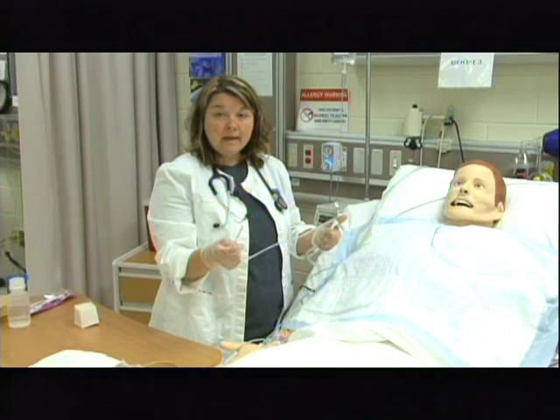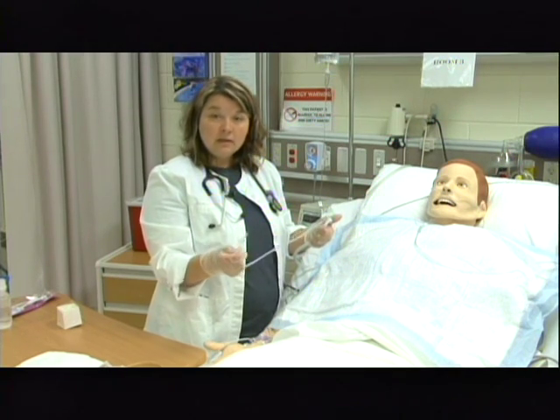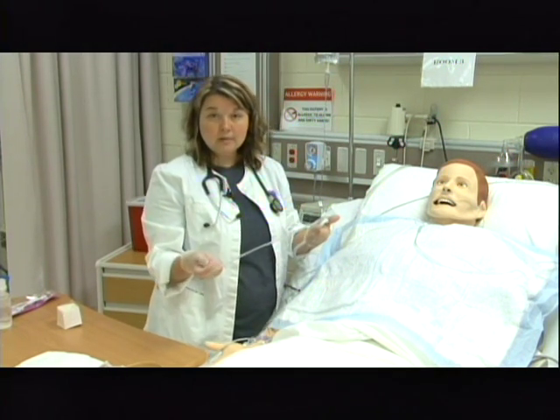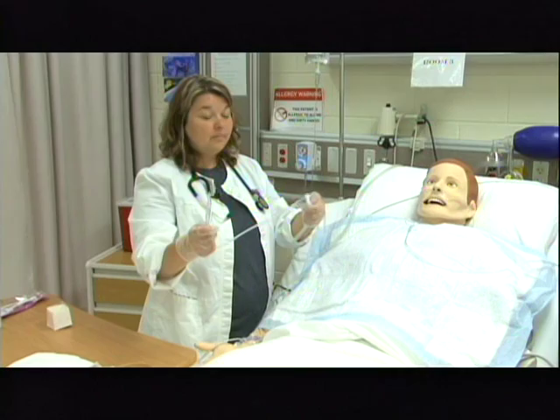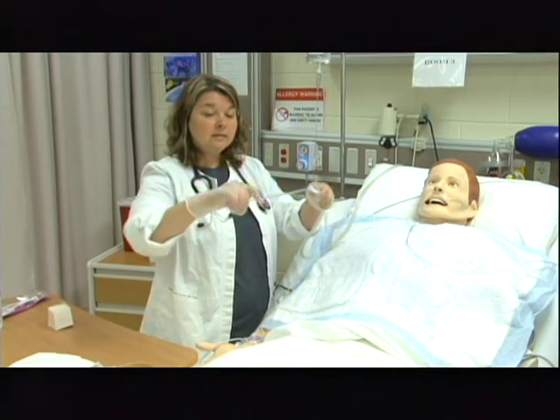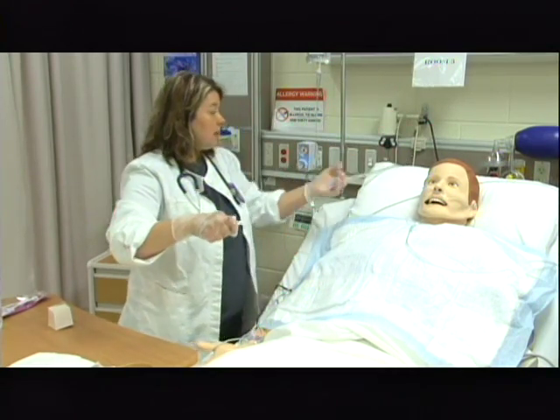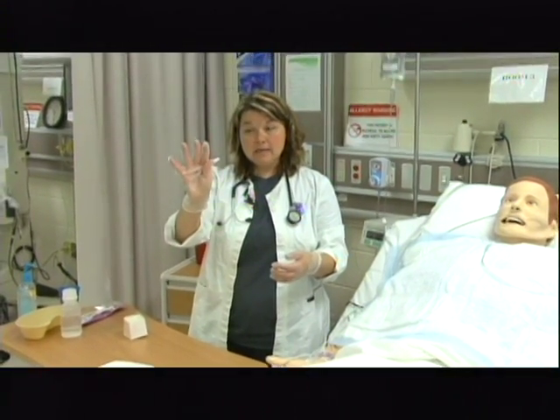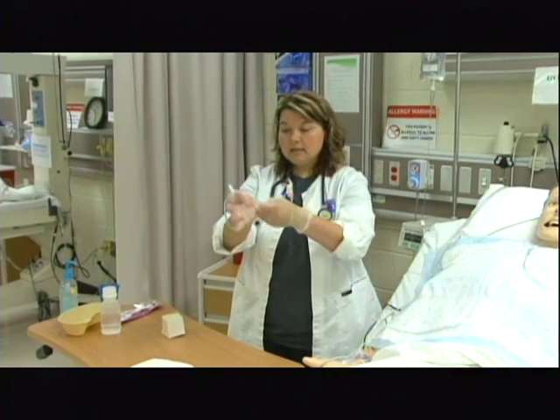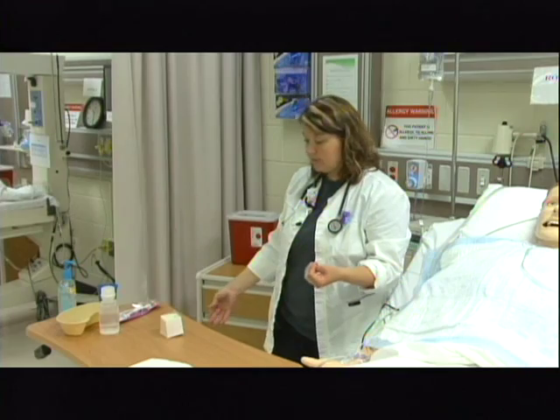I immediately clean the catheter of any secretions. I could do one more pass if necessary for a total of three passes, but Mr. Smith tells me his secretions are done and he's breathing better. I've monitored his pulse ox throughout the procedure and he says he is good. Now I'm going to wrap the catheter up in my hand, then take the other hand and wrap the catheter inside the glove, take the other glove off, and wrap the catheter up inside that glove. I would then dispose of it in the appropriate receptacle and foam my hands.